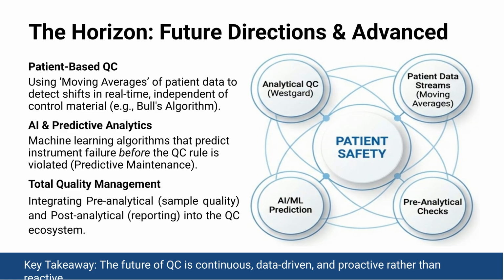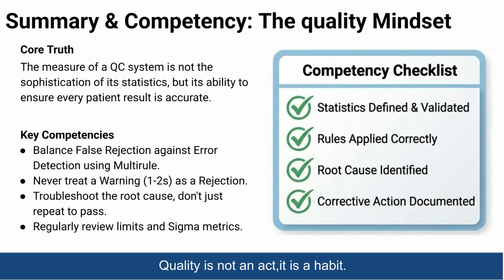The future of QC is continuous, data-driven, and proactive. This includes patient-based QC using moving averages and AI and predictive analytics to anticipate failures. Total quality management integrates pre-analytical and post-analytical checks. The measure of a QC system is its ability to ensure every patient result is accurate.